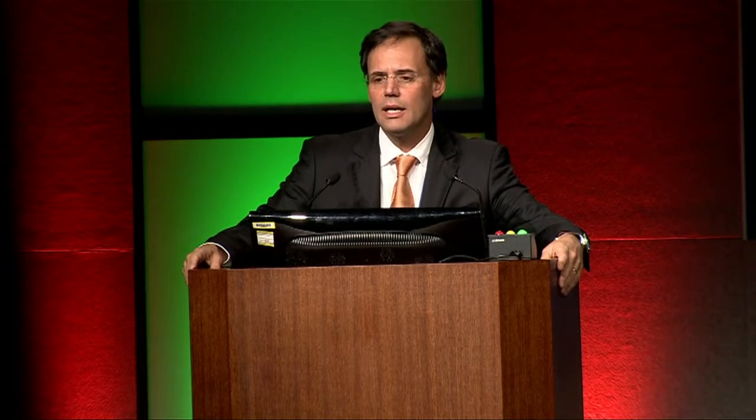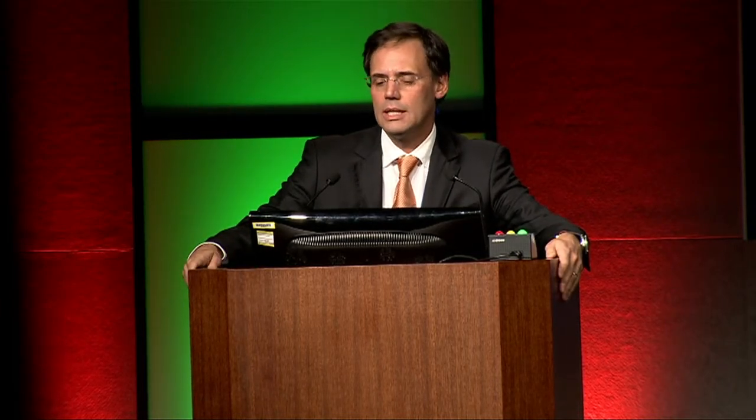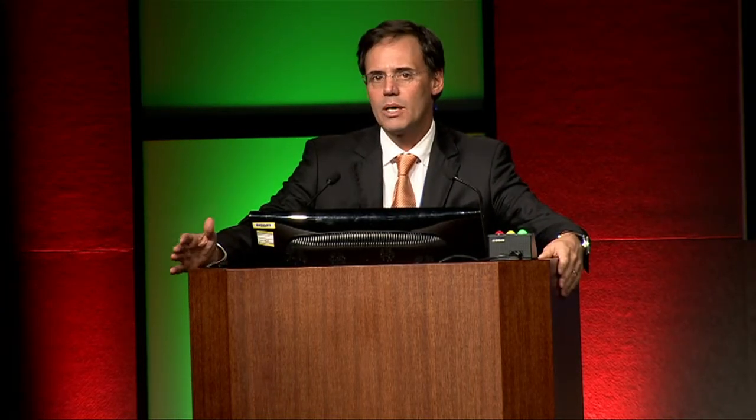Yeah, this is a very good comment. In fact, we think that AI is a marker of efficacy. We really want to see AI. If we were doing this case today, we would probably have used a 4.4 millimeter balloon to really open up the valve, and we would like to see more AI. AI in utero is very well tolerated because of the low resistance of the placental circulation and high left ventricular end-diastolic pressure, and for some reason that we don't know, the tissue heals itself and AI becomes less and less over pregnancy. Most of our patients are born with no AI at all, or a very small amount of AI.